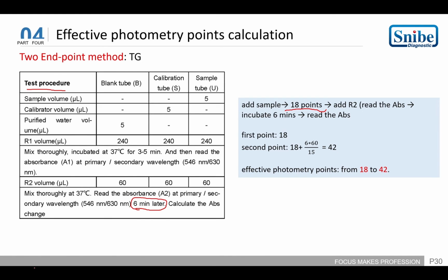Thus, the most important is the 6 minutes. 6 minutes multiplied by 60 seconds, then divided by 15 seconds. So according to the time we can calculate it.